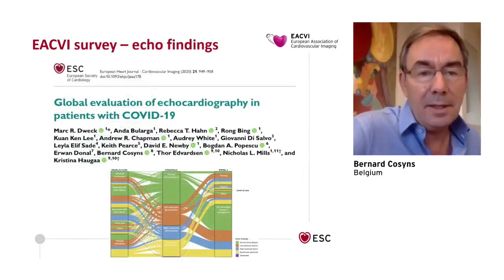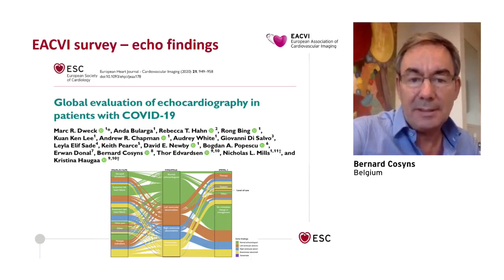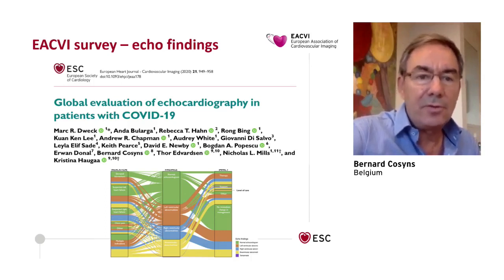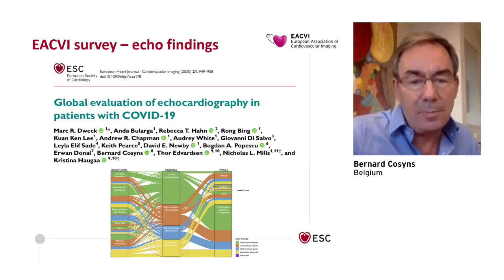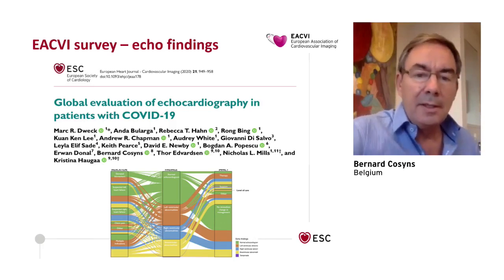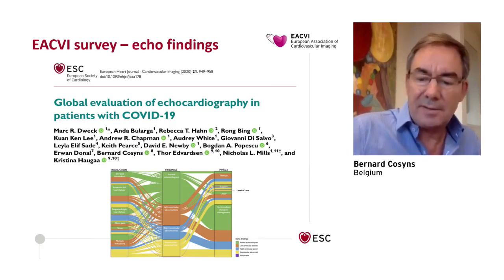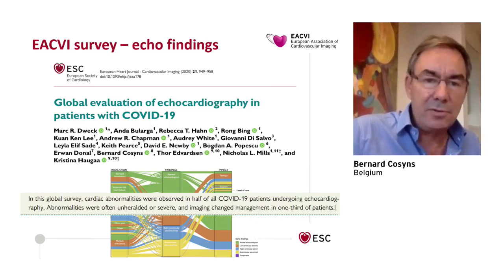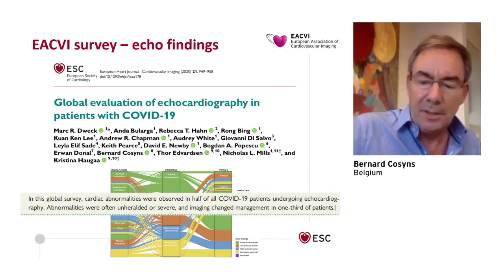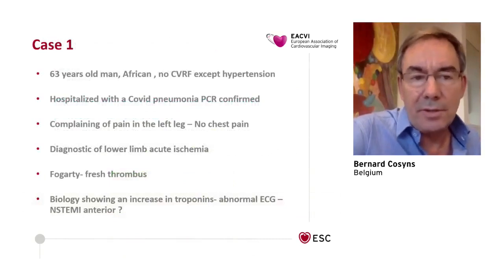Echo has a very important role to play in the global evaluation of patients with COVID-19. The survey that we recently conducted under the leading of Mark Dweck shows in these alluvial plots that when echo is performed, in 50% of the cases, the echo will be abnormal. Among these patients with abnormal echo, in 30% of the cases, in one third of the patients, this has changed the management of the patient. So there is certainly an important role for echocardiography to manage your patients with COVID infection. Now I'm moving to the first case.